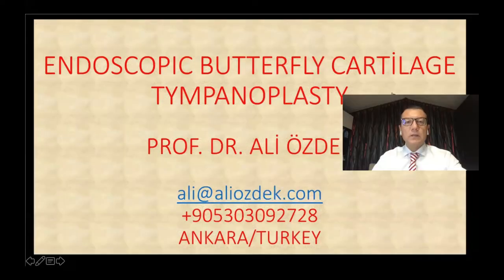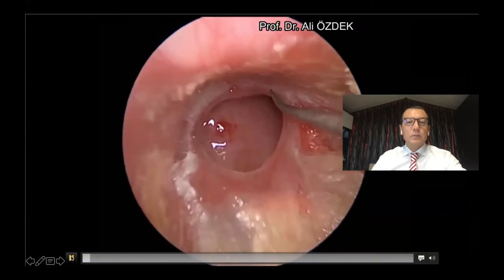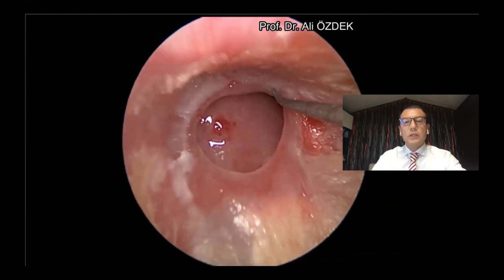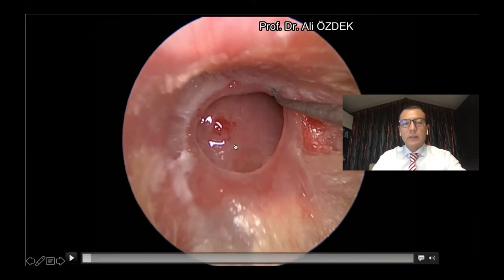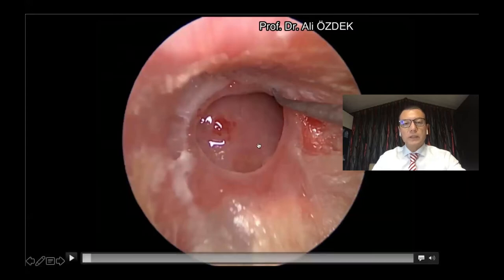I will present Endoscopic Butterfly Cartilage Tympanoplasty Technique in this video. We prefer this technique in small tympanic perforations like this, and these patients should have mild hearing loss. Because in this technique, we don't explore the middle ear and the ossicles. Therefore, we apply this technique for small perforations of the tympanic membrane with mild hearing loss.